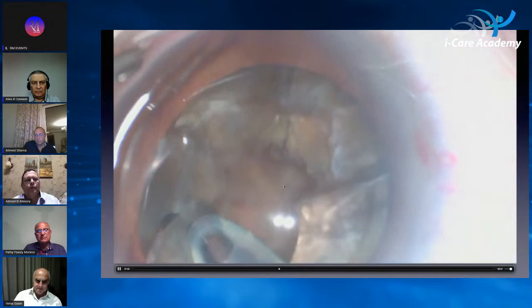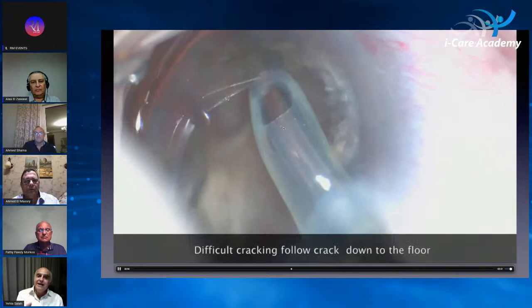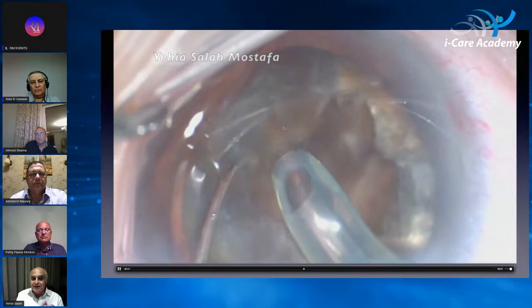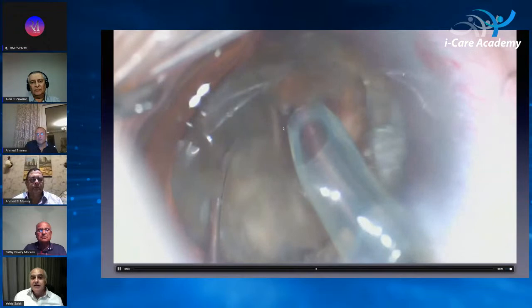You see how valuable is the long exposure of the tip, because you can embed inside and you can make the best value of the vacuum. So you're holding the phaco tip as a fork and the knife. The fork is the tip and the knife is the chopper. This is the Nuhand chopper. I do vertical splitting, and this is very useful in hard cataract and small pupils because you can see what you are doing. You are splitting the fibers to the last fiber, preventing the crack.